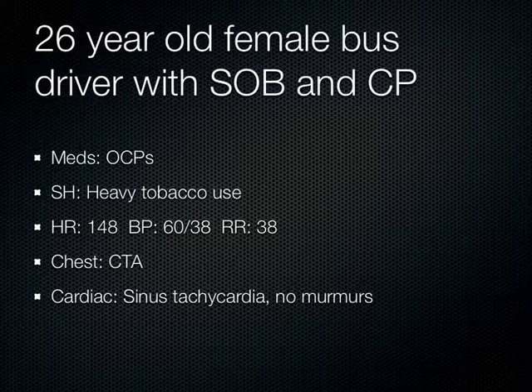How do you diagnose it? A CAT scan, but we can't put her in a CAT scan. He was like, well, is there anything else you can do? And then I was like, oh yeah, I can do an ultrasound. And so I brought the ultrasound machine over, and I did this.